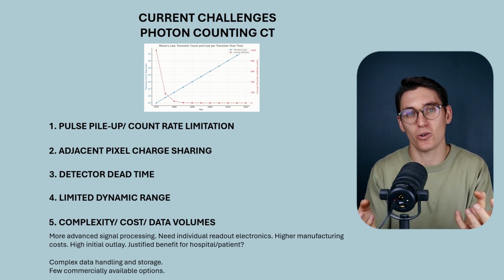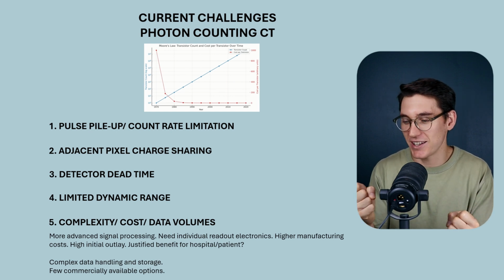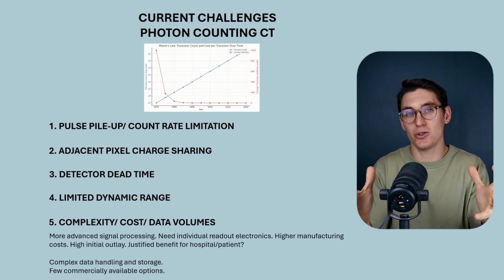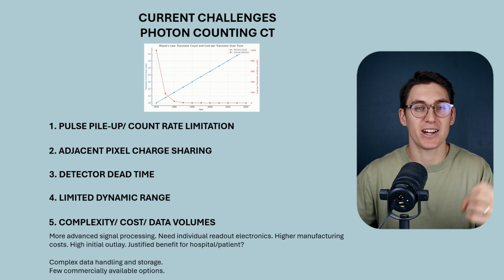Manufacturing these components is also much more expensive currently, and the hospitals need to justify the cost, whether it's beneficial to the hospital or whether it's beneficial to the patient. And because this is a new technology, there aren't that many providers here. We need competition to drive down the cost.